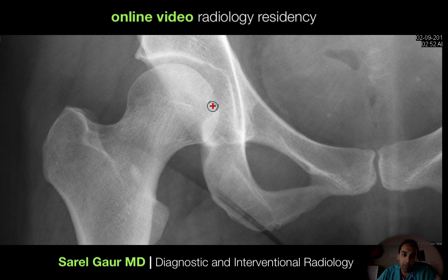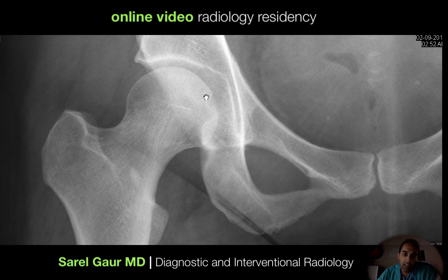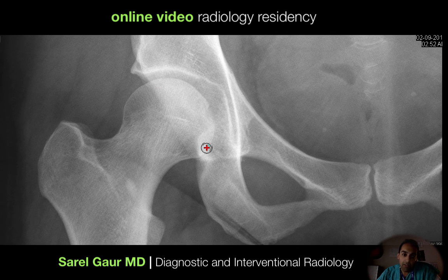Moving on from the femoral neck, I'm now looking at the femoral head. I want to point out this is the subcapital region and this is the basocervical region of the neck. Femoral neck fracture is definitely something to focus on. Femoral head fracture is less common, although I'm looking for it — in the setting of a hip dislocation, you can get a femoral head fracture. So I'm just looking at the rounding curvature of this femoral head.